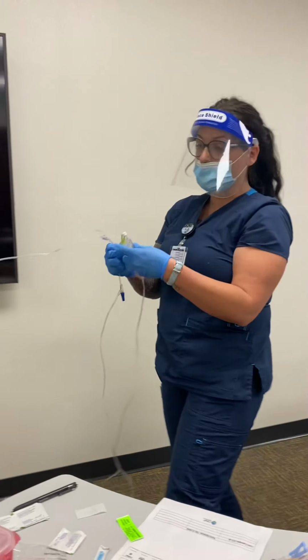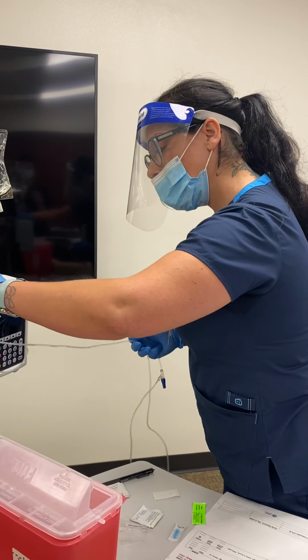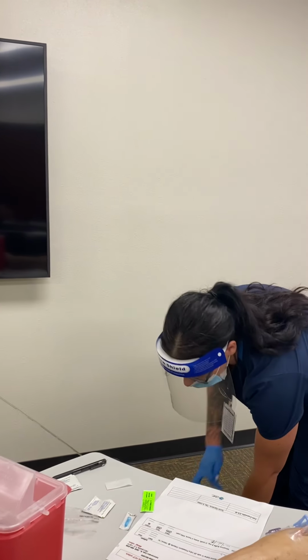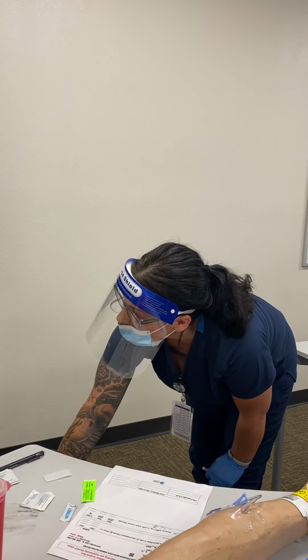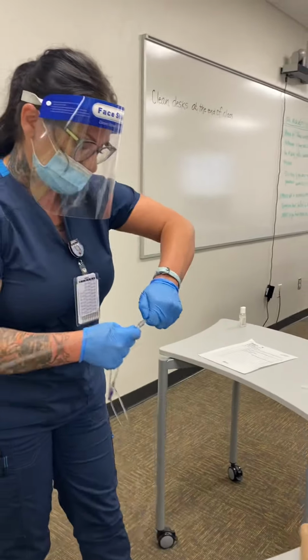Okay, so my tubing is primed. I'm gonna go ahead and set this in here while I prime the rest. Okay. It's coming, it's just slow. This tubing's been used a bit. All right, so we would maintain aseptic technique.